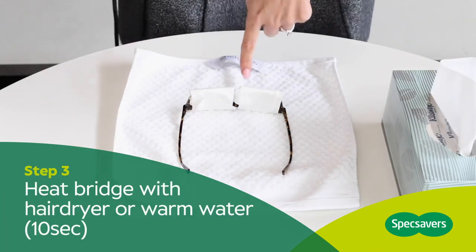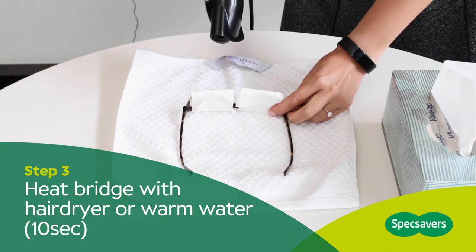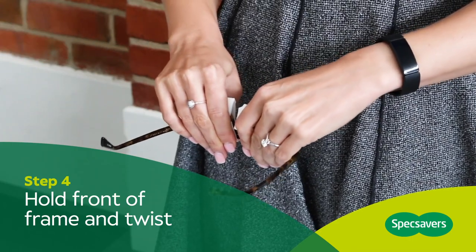Heat the bridge — this part here — with a hairdryer. Hold the glasses securely by the point near the bridge and twist carefully, applying some pressure.